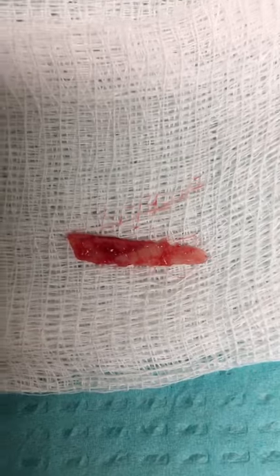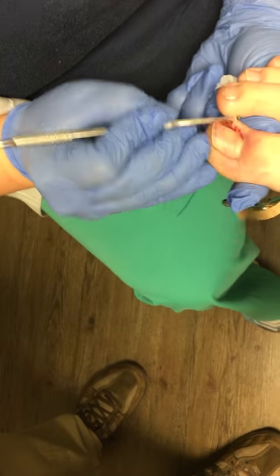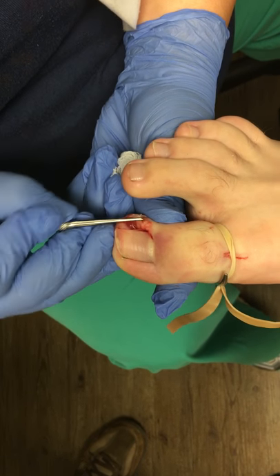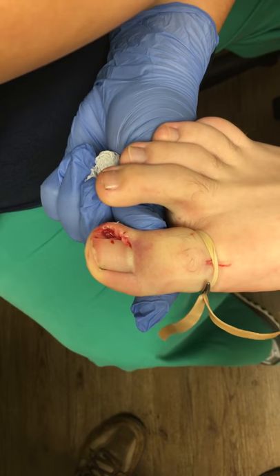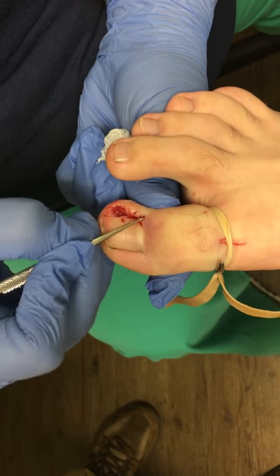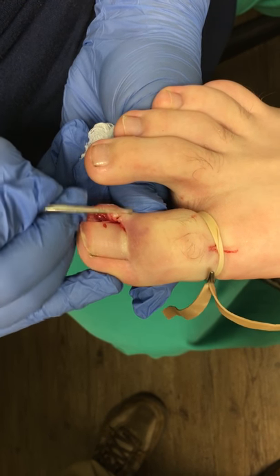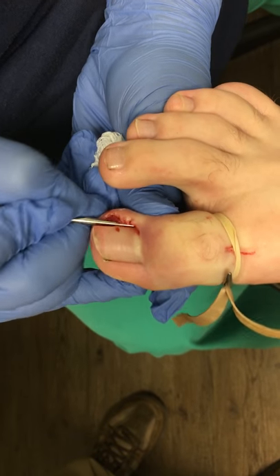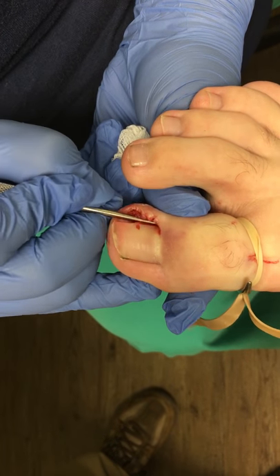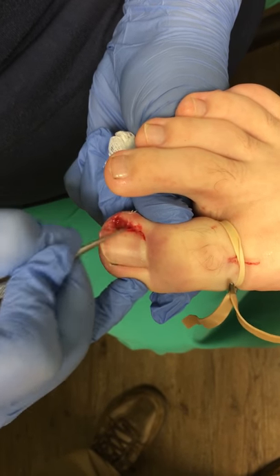Then we follow it up with a curette and make sure we don't have any residual nail pieces in there. I also look for any soft nail or any dead skin — you pull out a lot of stuff when going through this. It's okay to be aggressive on the side, but watch how aggressive you are back underneath here, especially if you're not doing a matricectomy. If I'm doing the matricectomy, I can scrape all I want back here because I'm destroying it anyway. But if I'm doing a simple one, it's a light wisp.